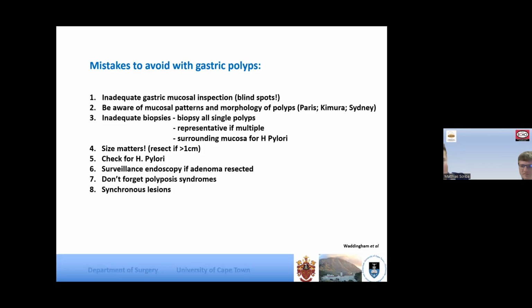Yes, I think the answer is definitely you should be. The truth of the matter is I don't think many of us are doing it properly. You just get through the scope as quickly as you can. Let's be honest, if there's 20 on a list, but yes, we should be. And biopsying the normal background mucosa is ideally done according to the Sydney protocol. And it's something we should get into better habits of doing.